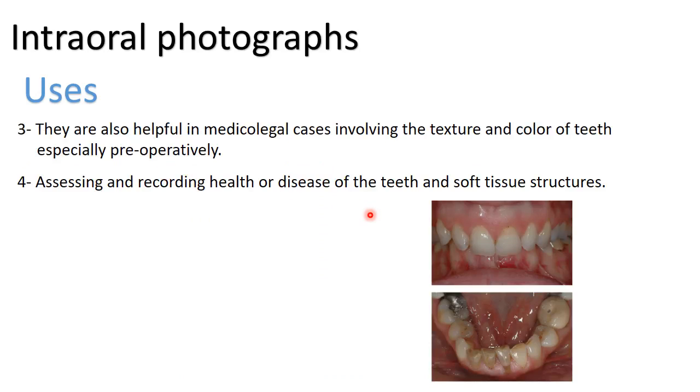And they are also helpful in medico-legal cases involving the texture and the color of teeth, especially preoperatively. Sometimes the patient develops a white spot lesion or caries, and sometimes it happens before and we didn't pay attention. So for this reason, we can show the patient what happened with the pre-treatment photograph, and we can compare the results.